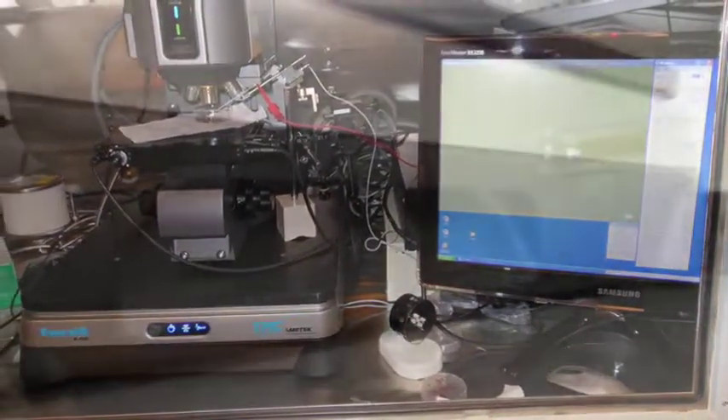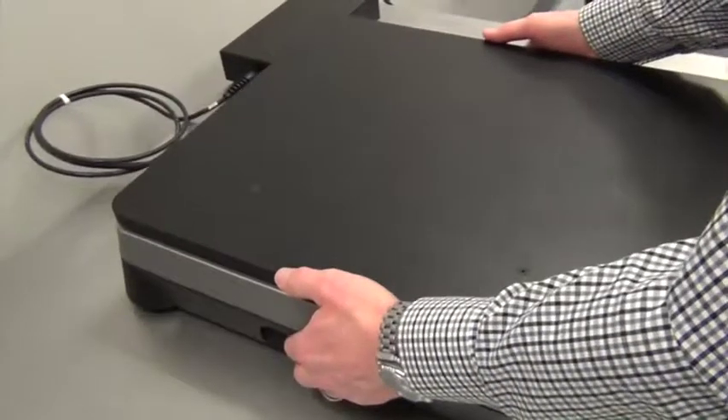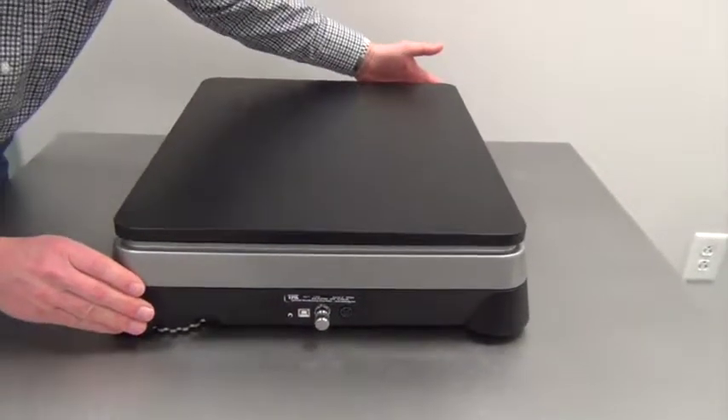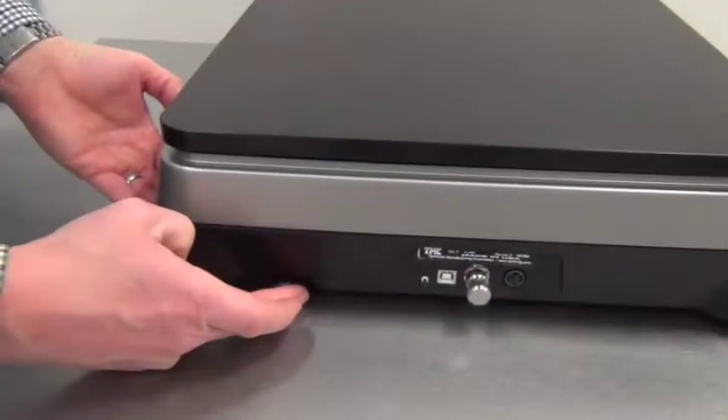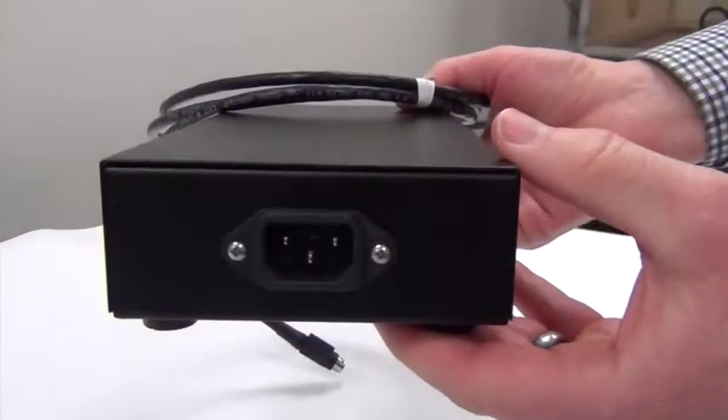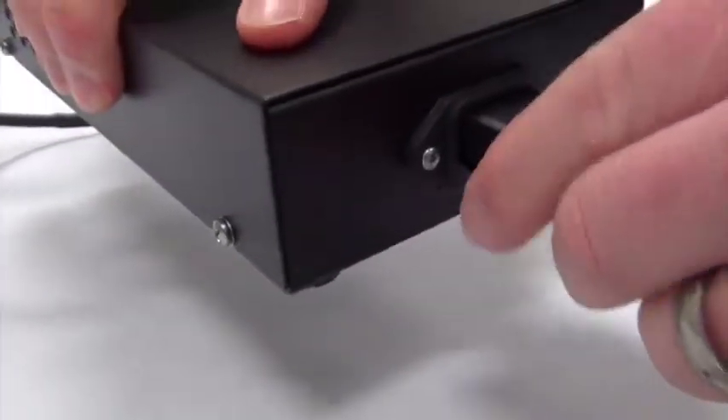The unit is designed with built-in handholds, allowing for easy unpacking and setup. The K400 is simple to install and its manually adjustable leveling foot accommodates uneven tables and benches. The K400 accepts all standard international AC power cords.